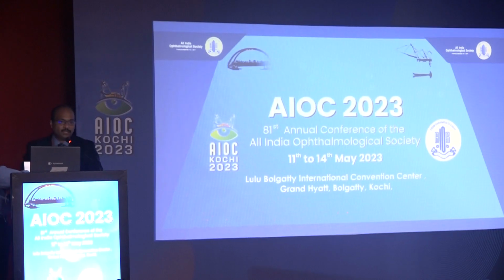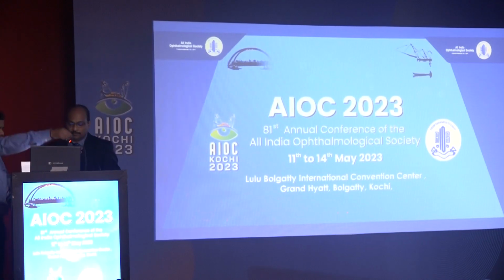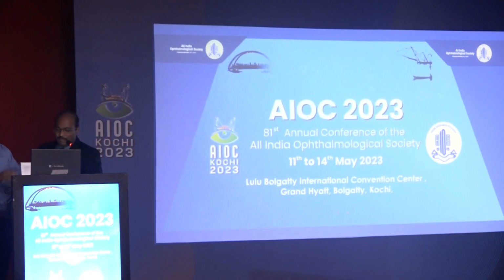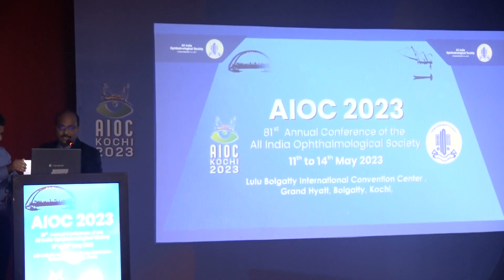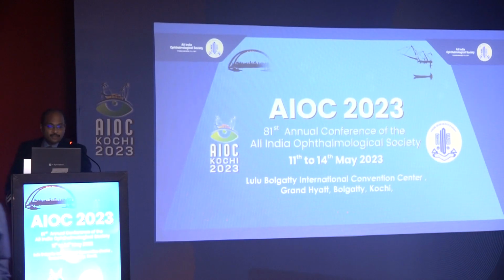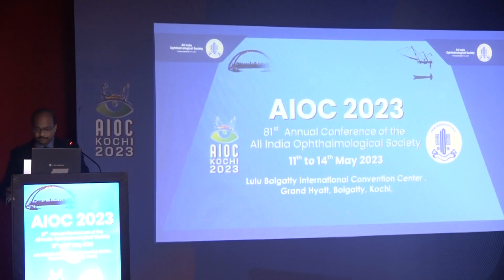So OCT is something that has taken the diagnostic world of retina by storm over the last maybe 1.5–2 decades, and it's really become quite like what CT and X-rays are for a physician. Okay, so are my slides up?